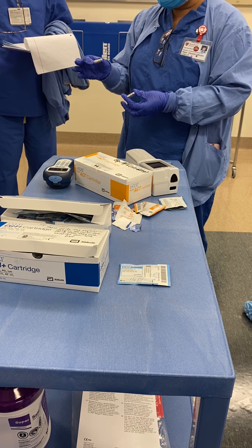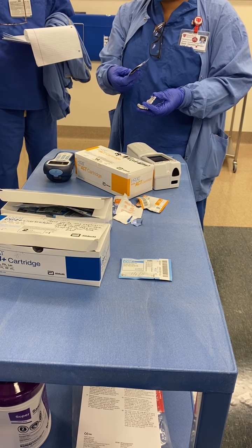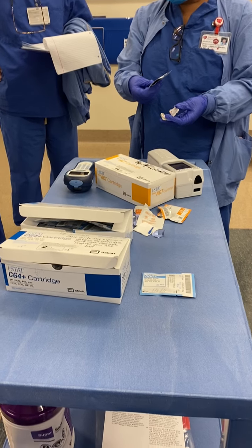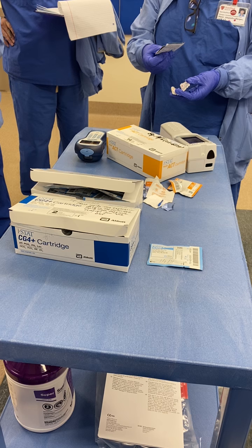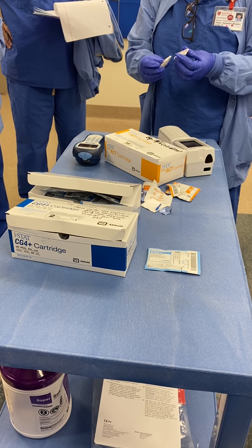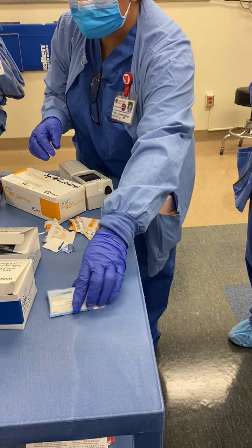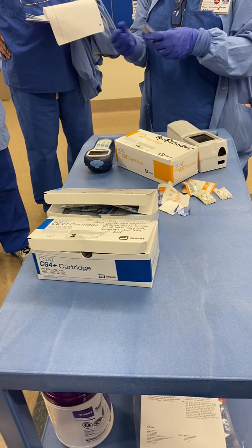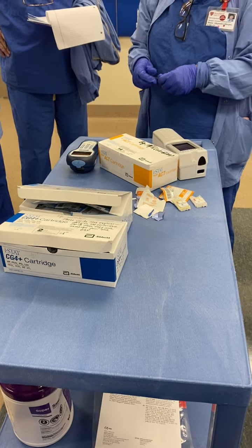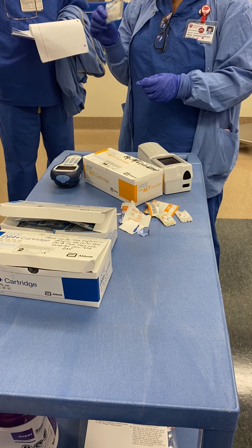So CG4: pH, PCO2, PO2, lactate, bicarb, base excess, and oxygenation, SO2. So you'll be able to get a reading from the CG4. So what is CG4, CG8? That's just the model, just like the name. It's just different tests, right? And this one's called CG8.